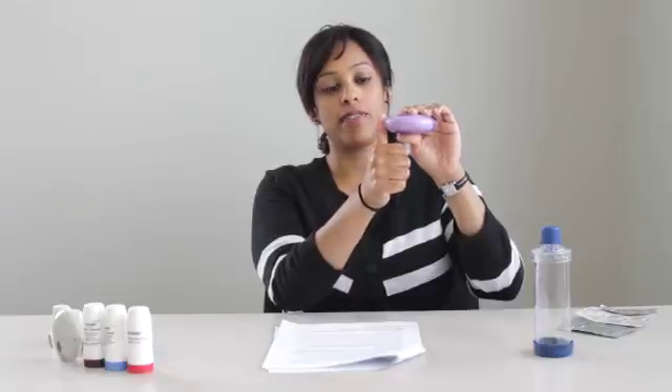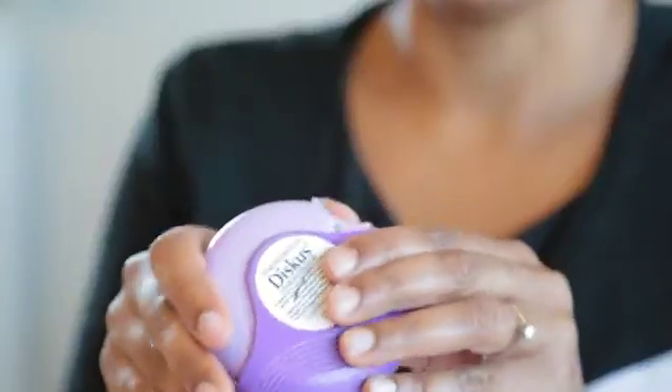Now I will show you the discus inhaler. Hold the discus in one hand parallel to the floor. Place your thumb in the thumb grip and push the discus away from you, all the way until it clicks.